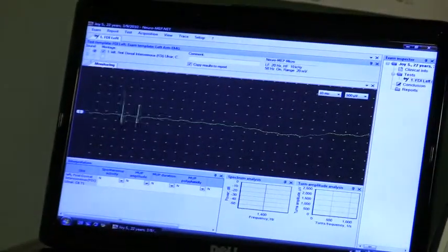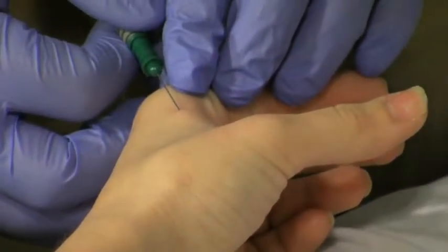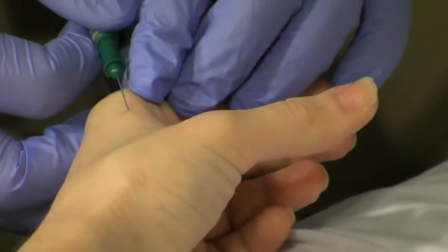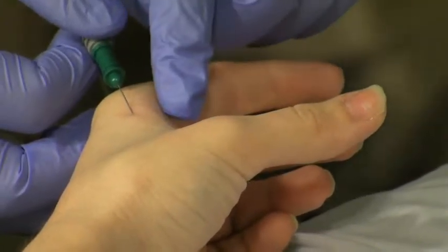So now I'm going to do the insertion activity. And I'd like you to focus here first. Here. Insertion. Insertion. Insertion. Okay. So I'm exploring the muscle.